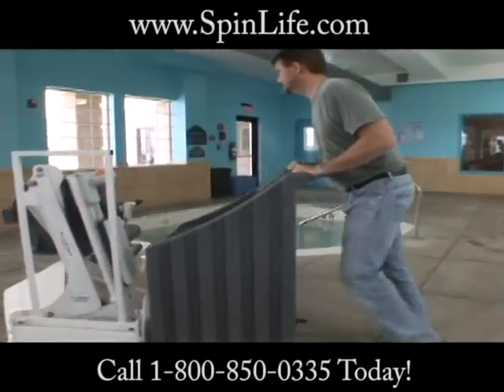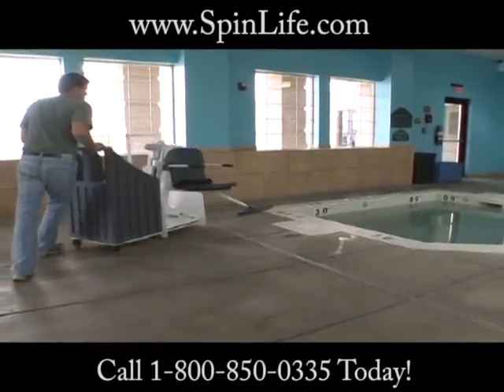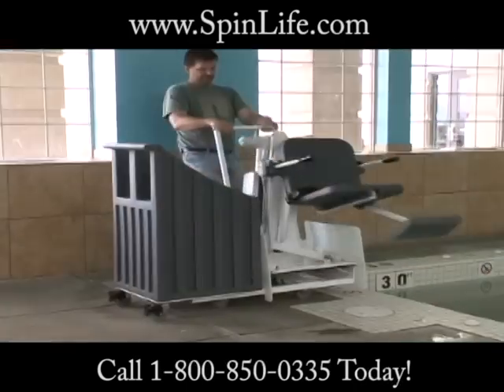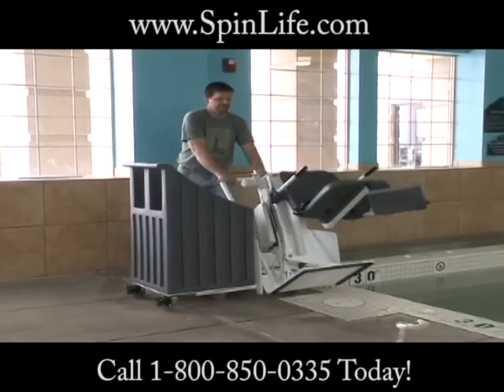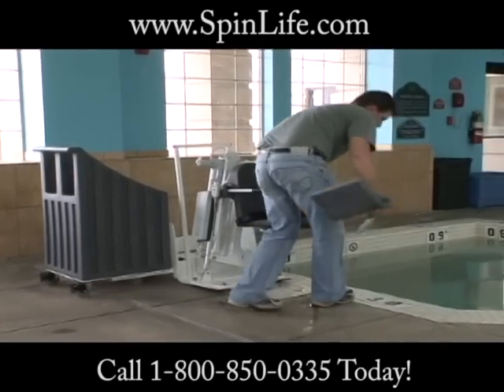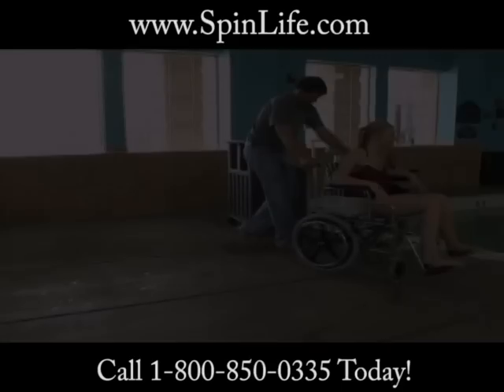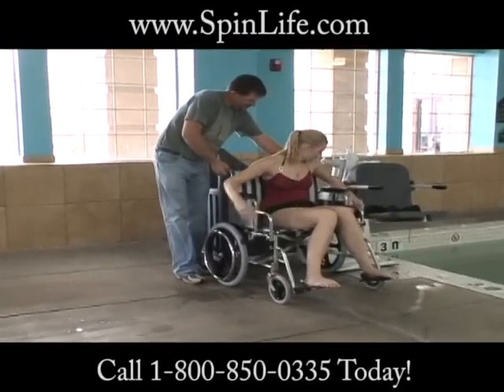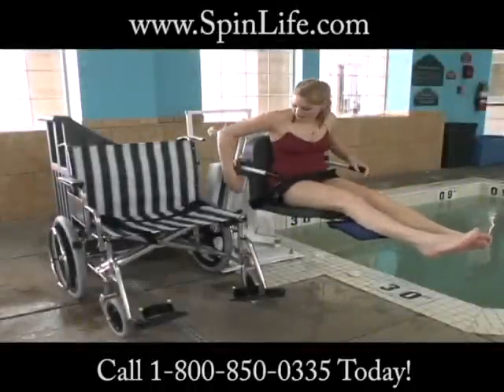Do you have an in-ground spa? The Patriot Lift can be easily moved on the deck to be used on an in-ground spa with or without benches. Once you have set the lift at the spa location, the footrest can be removed easily by pulling the release pin and simply dropping the footrest away from the mounting area below the seat, allowing the seat of the lift to rest on the spa bench. Aqua Creek also offers a pull-out style leg rest that can be used in this type of application.